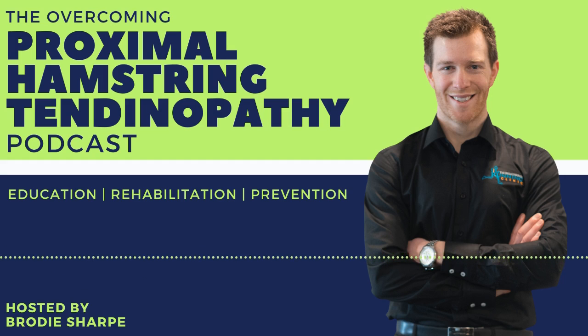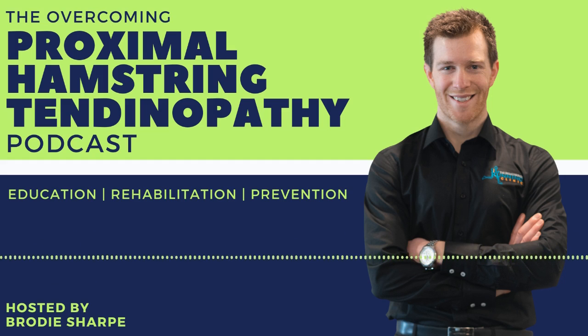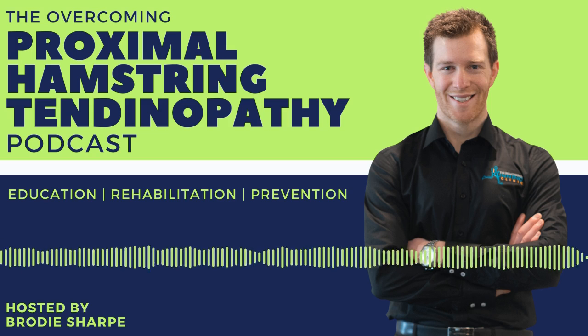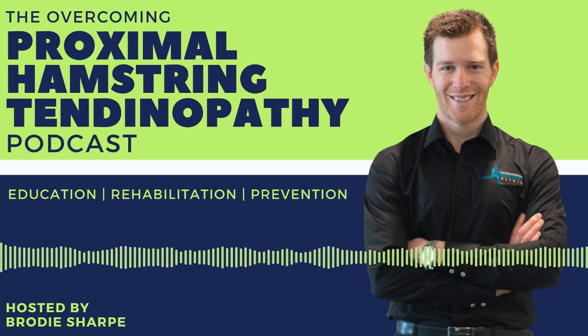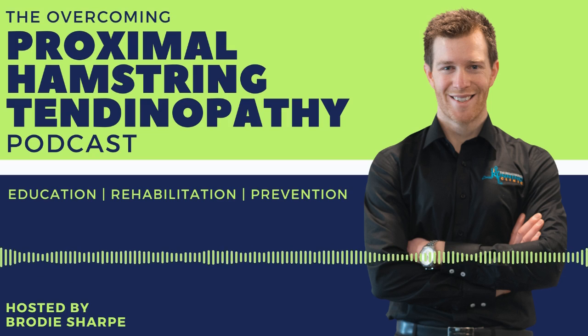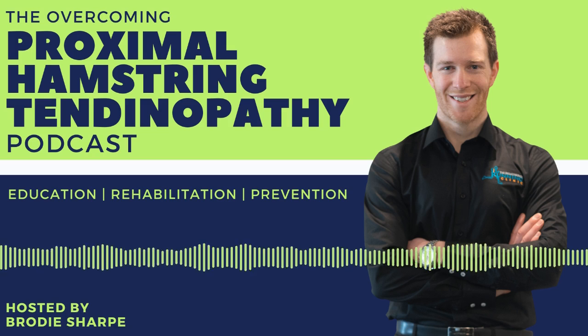So generally, it's good to give Shockwave before injection. A top tip for somebody using Shockwave is that one of the worst patients who will not respond to Shockwave is somebody who had multiple injections. Suppose you had a lateral hip patient who had 3 or 4 steroid injections, they don't seem to respond. And I've got very good research to back me up: multiple steroid injection is a poor prognostic factor. So if you get a patient who had 4 injections in the hip, or 3 into the tennis elbow, you might not get the same response.